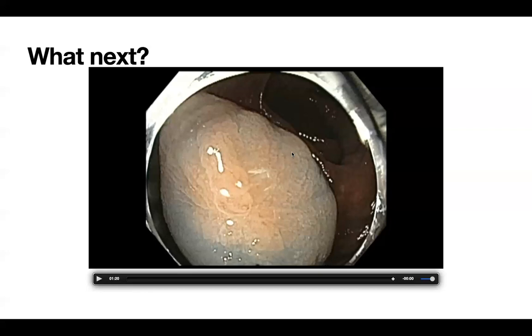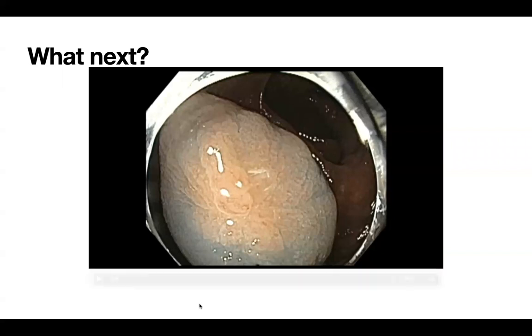As long as you change the direction of the needle, you can get a good lift like we achieved here.